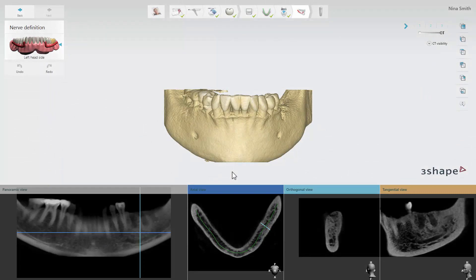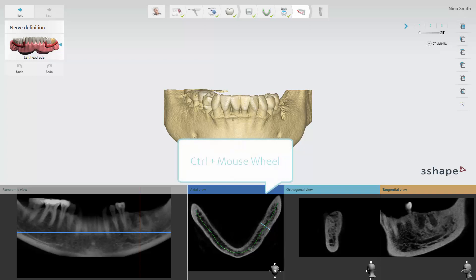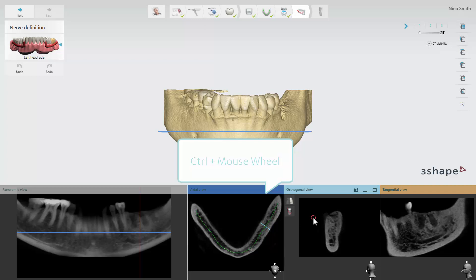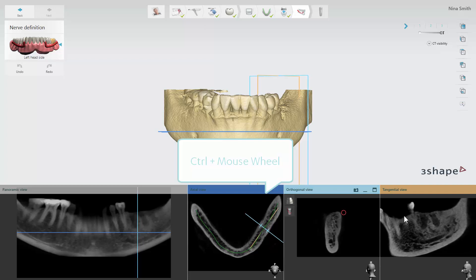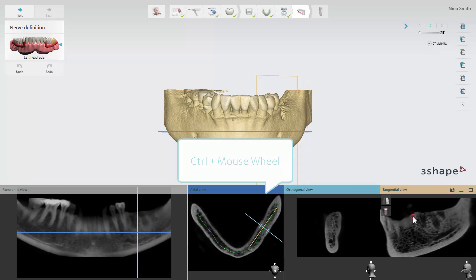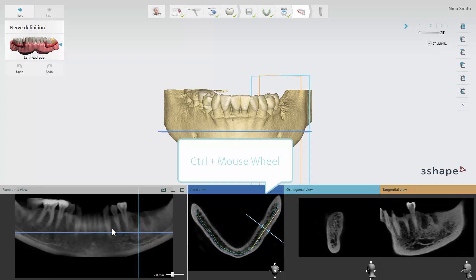For mandibular surgery we have to define the position of the nerve at the nerve definition step. Hold the control button down and use the scroll wheel of the mouse to move through the scans in axial, orthogonal, tangential and panoramic views to trace the nerve.